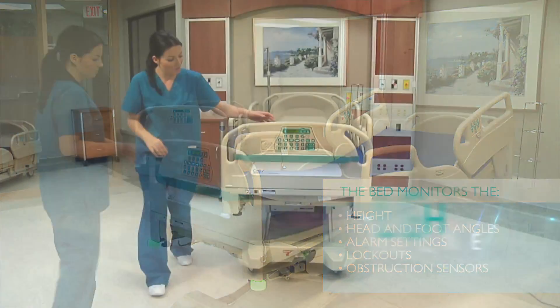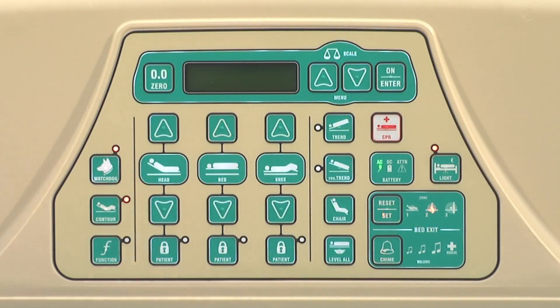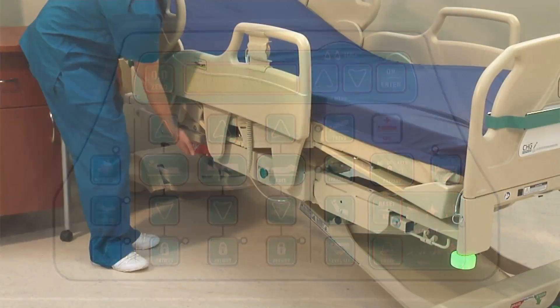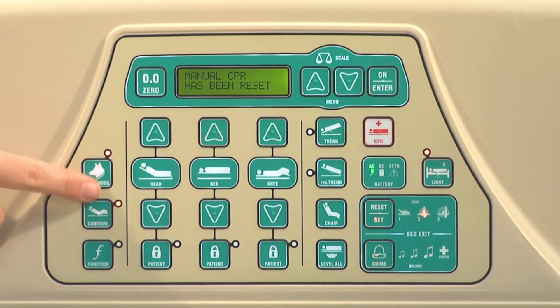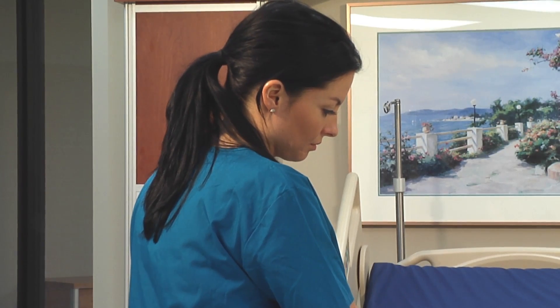If more critical settings of the bed are altered, the bumper lights will turn red. These changes include a patient setting off the bed exit alarm and the manual CPR handle being pulled. If the manual CPR handle is pulled, you will need to reset the Watchdog feature. Simply hold the Watchdog button down and follow the instructions on the screen.